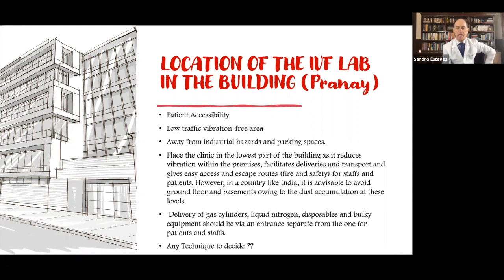Obviously, the air quality control needs to be much more stringent in a situation where the clinic is located in a polluted city. So we actually need to understand the environment and the number of people working in the lab. These are important issues to consider when you design the infrastructure.